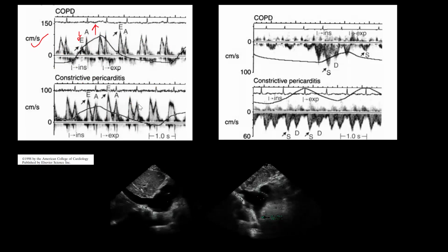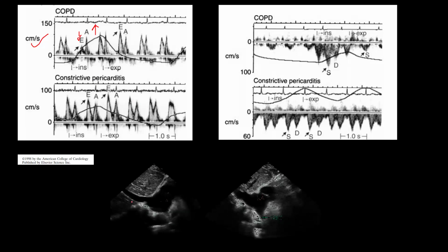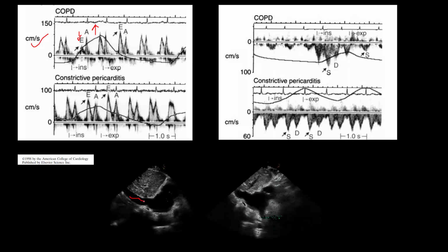اوكي لكن عشان اميز بيناتهم I go to the SVC. SVC not IVC. How can I get the SVC? Look here. In the subcostal, this is the SVC. This is the IVC. صح كده يا شباب?